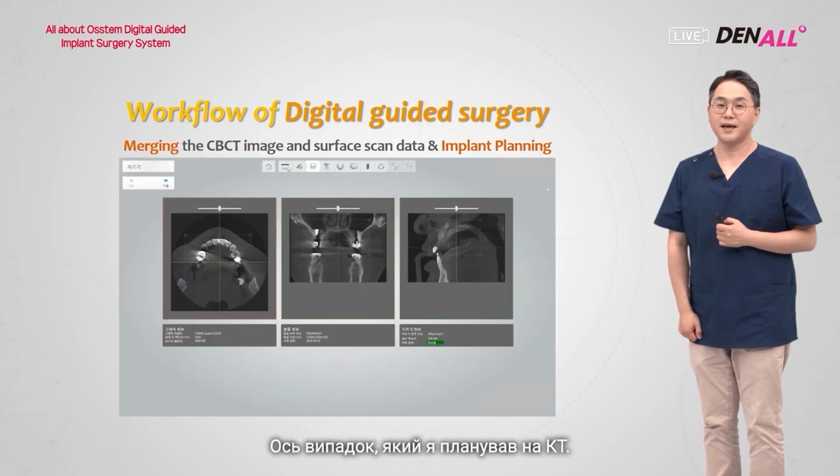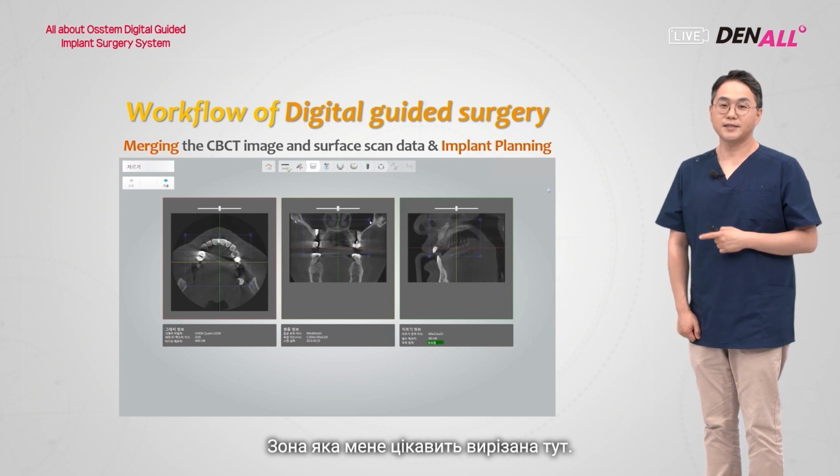This is the case that I planned on CT. My area of interest is cut here.